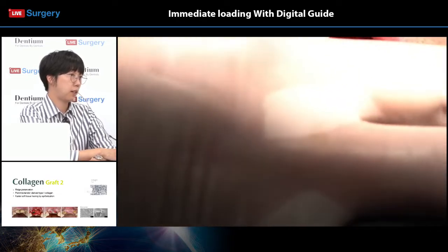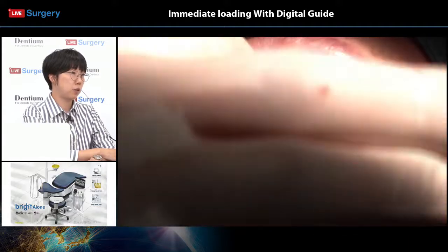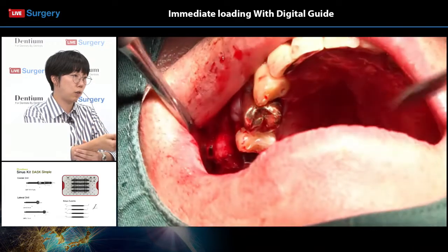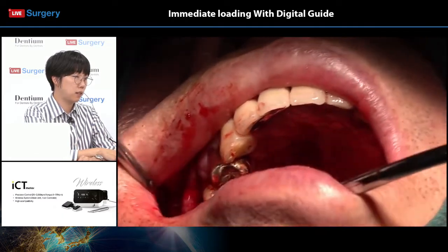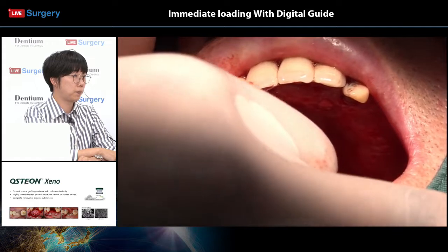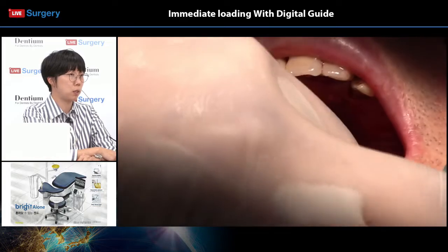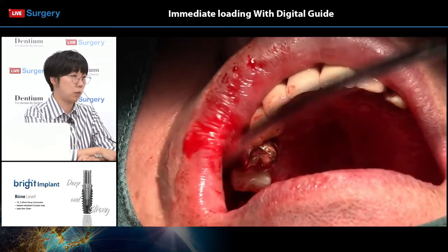Oh, and in cases like this where patients have a hard time breathing through their nose and are gasping continuously during the surgery, it is always very important to make sure that the patient doesn't swallow anything when using small instruments like a hand driver or an abutment. There are always accidents in the dental clinic where the patient swallows something during implant surgery. It would be lucky if it goes into the GI tract, but if it goes into the airway, then it's an emergency. So please make sure that the patient's throat is closed and nothing falls into the patient's mouth.